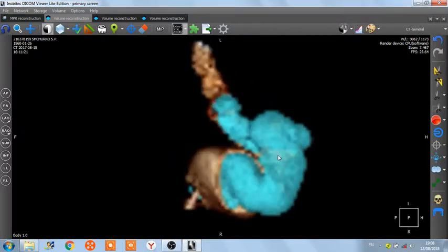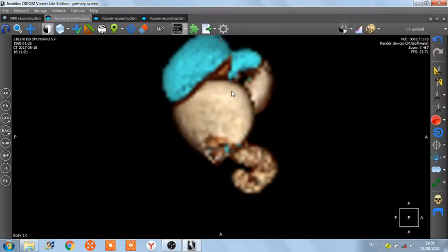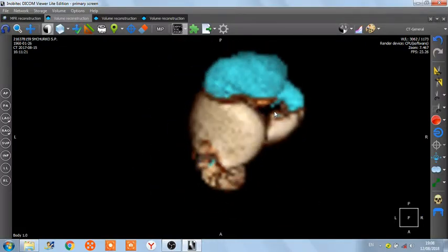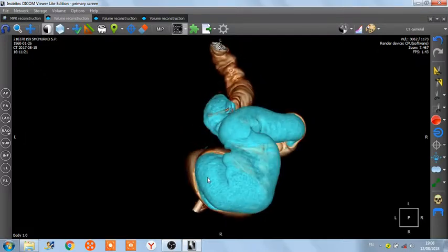It's clearly visible here, but on the downside the middle one is completely flat because they squeeze between bones. So down they pressed in the bones and make them flat in the medium section.